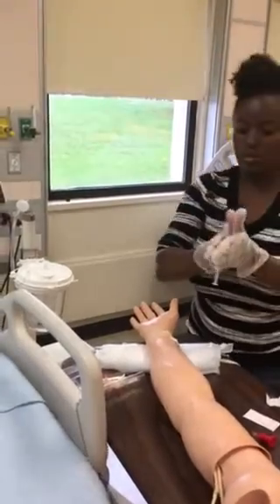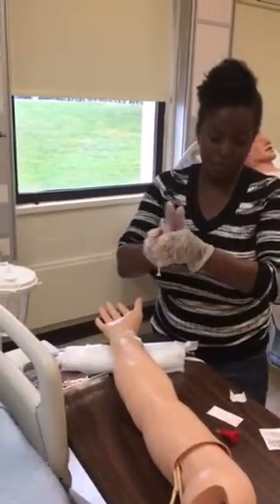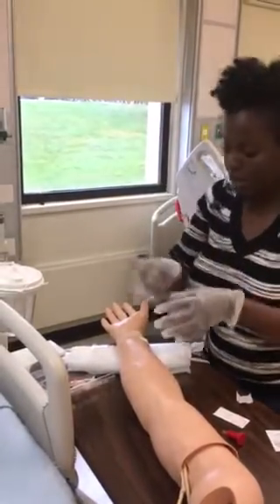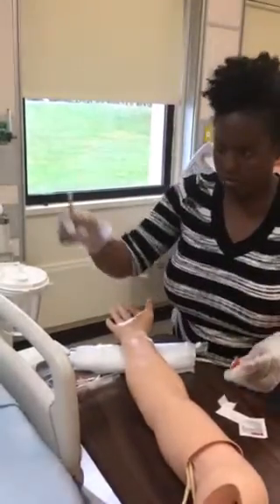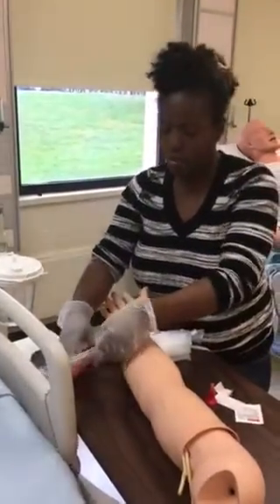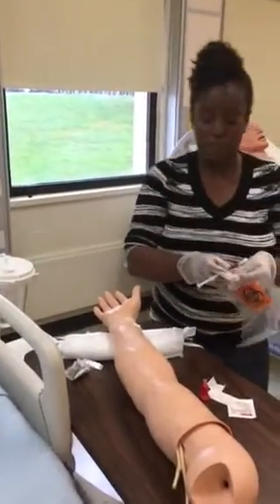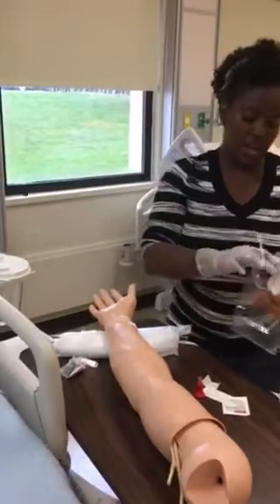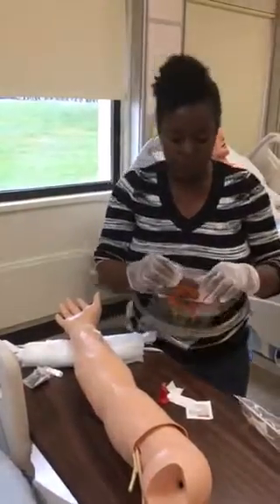Cover, and I'll start mixing it with the heparin. And then I will discard my needle, my needle cap into the sharps container, and I will place my sample into the bag. If I'm not going to use the sample within the next 30 minutes, I'm gonna place ice in it. And if the sample stays out more than 60 minutes, I will discard the sample.